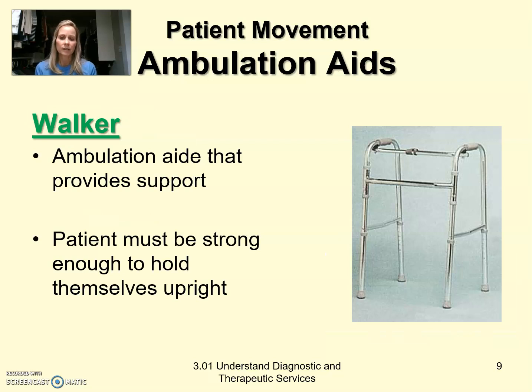All right, a walker is an ambulation aid that provides support, and the patient must be strong enough to hold themselves upright. So as long as they can walk and stand, usually they can use a walker.